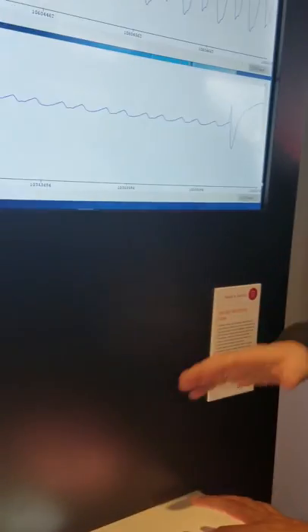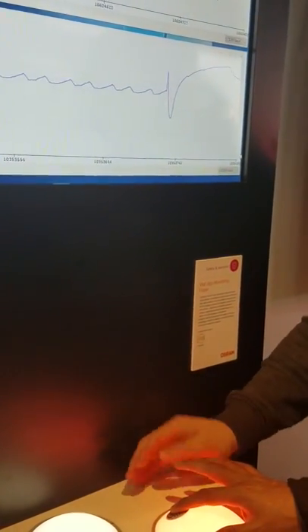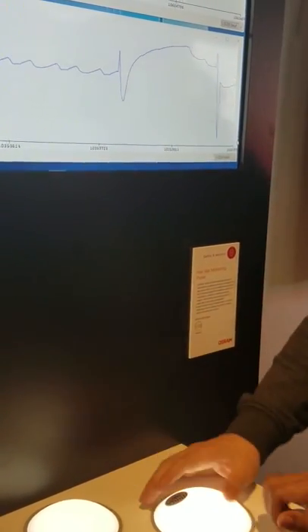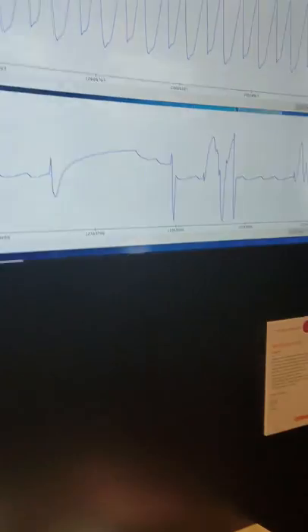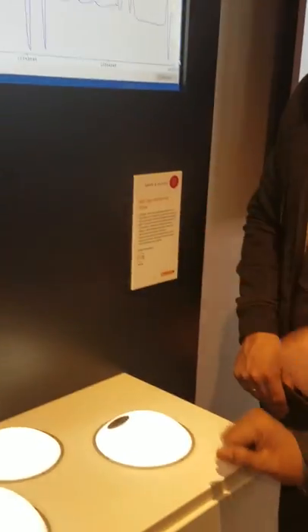The important thing is not to press too much, because if you really change the pressure, you force the blood out of your fingers. So just place it in the center, and then you'll get a bit of the signal.